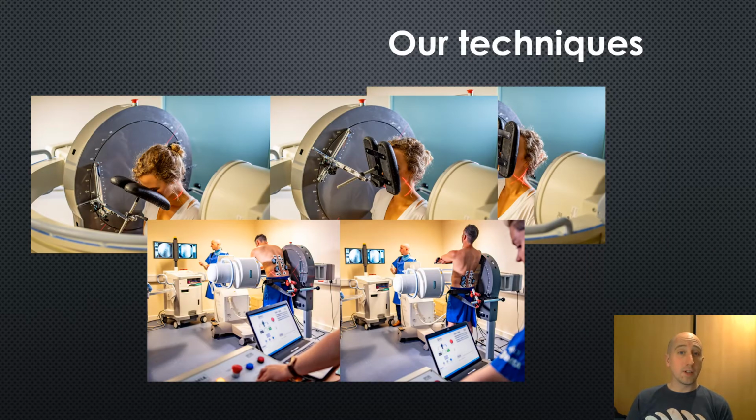The way that we investigate the spine mechanics with high accuracy is by using advanced imaging techniques such as low-dose video fluoroscopy and guided motion to make sure that patients and participants are all doing the same motion, removing behavioral factors, and then a small computer program which is a bespoke image tracking software to accurately measure the motion of osseous or prosthetic structures in vivo.